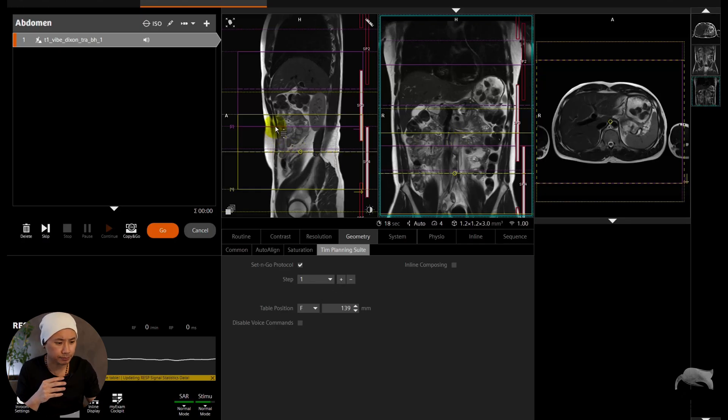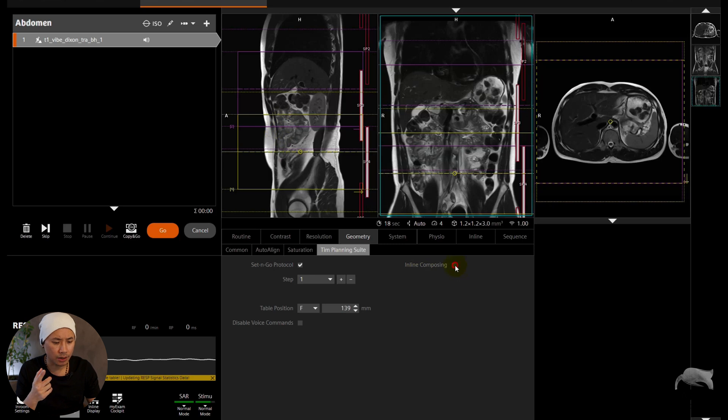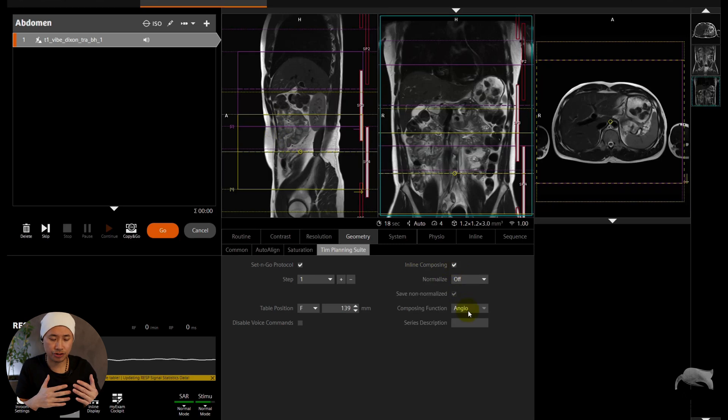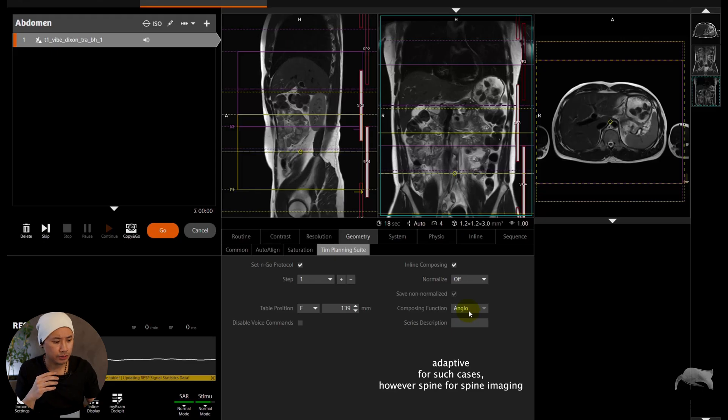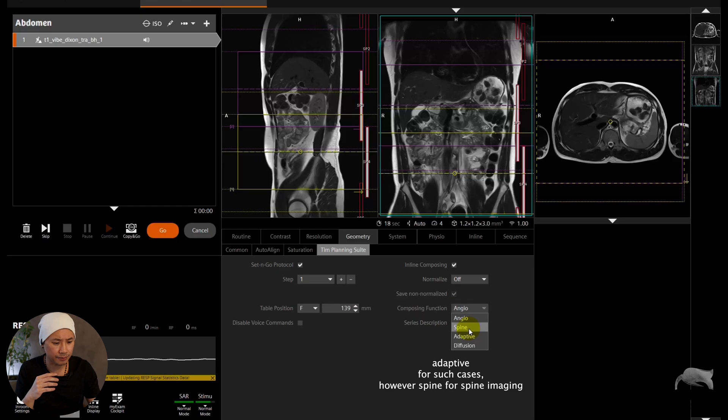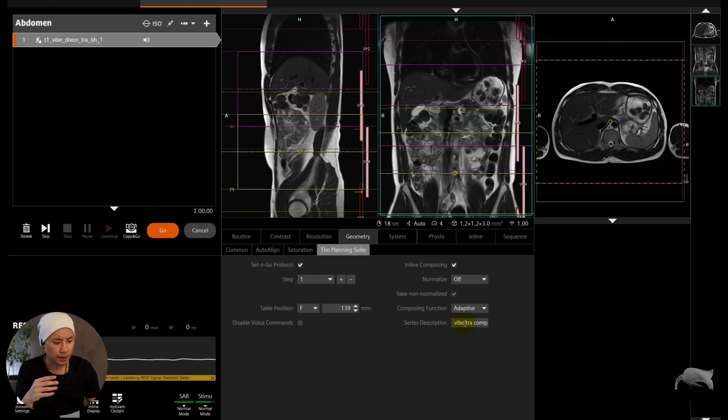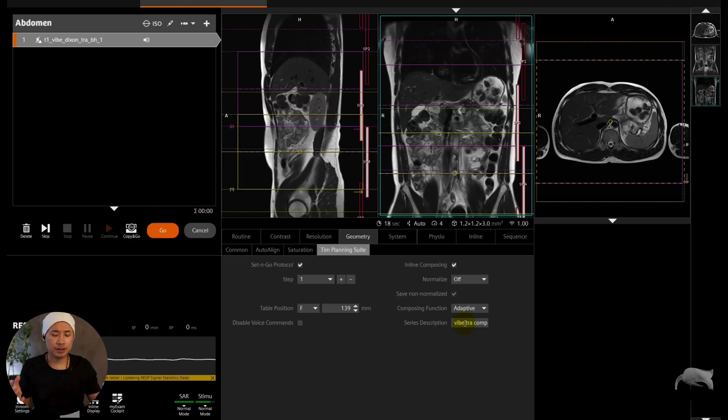And then you go to Inline Composing. With the Inline Composing, you will automatically stick together whenever it's finished. So we have a multiple composing function here. I just use Adaptive.